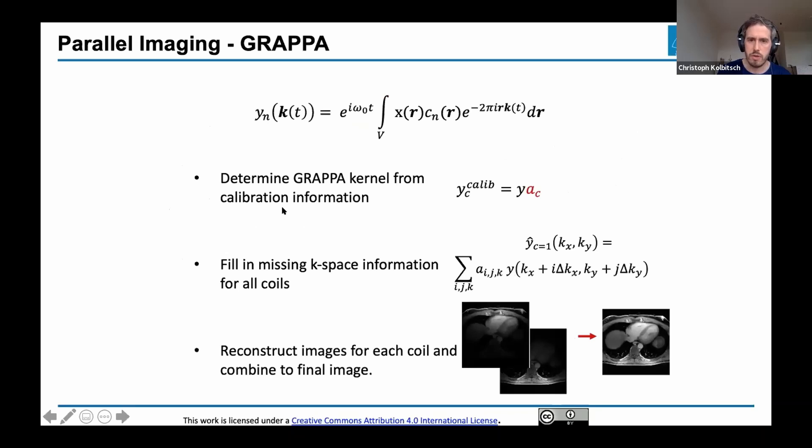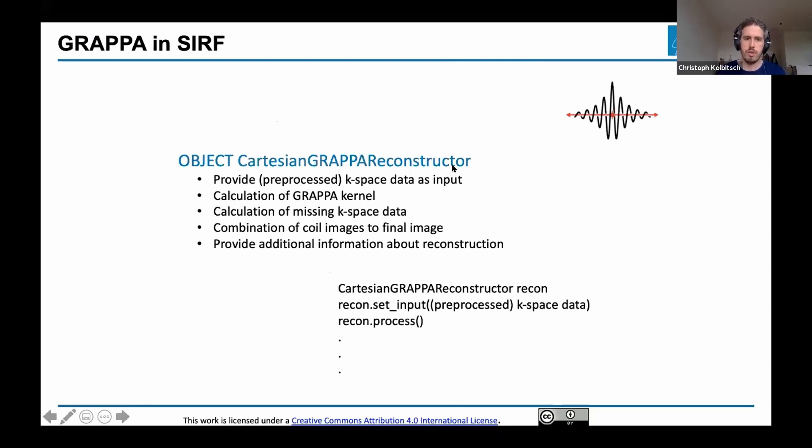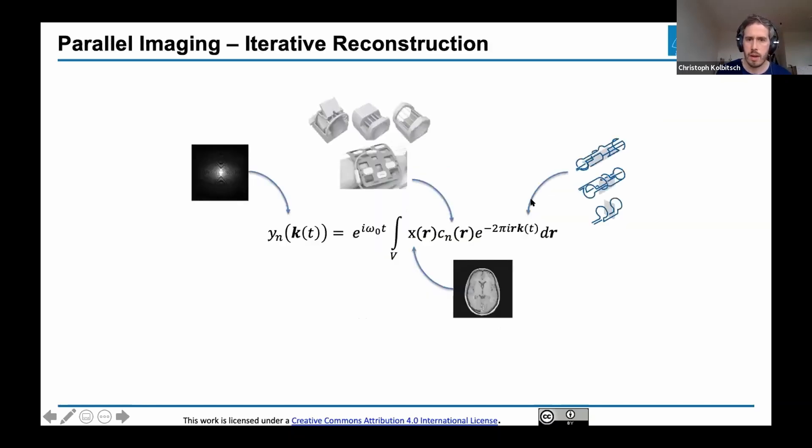There are quite a few steps involved in GRAPPA. First, I determine the calibration lines and calculate calibration information. Then I fill in the missing k-space lines with this information, reconstruct an image, get an image for each coil, then combine it to one final image. Luckily, we don't have to do any of that because it's already part of Gadgetron and SIRF. There's an object which is a Cartesian GRAPPA reconstructor that just needs the preprocessed k-space data, and you can say process and it does everything.